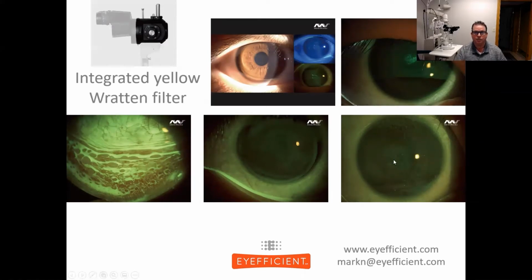It does enhance it for you, but also for video purposes and for showing your patients normal corneal staining. You could also record a video of maybe tear film breakup time or something in video. So there are a lot of uses with that.